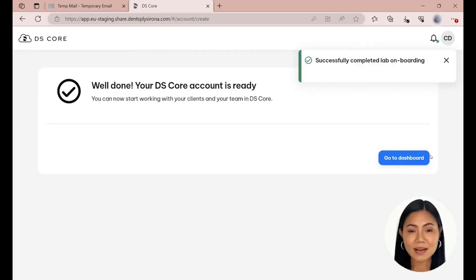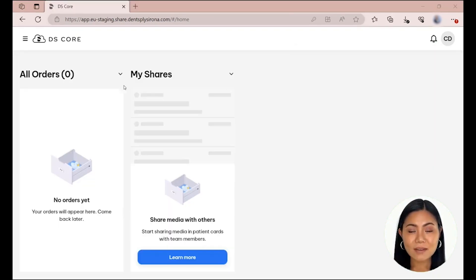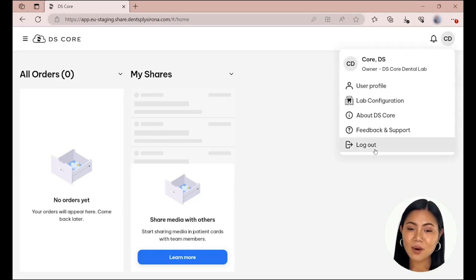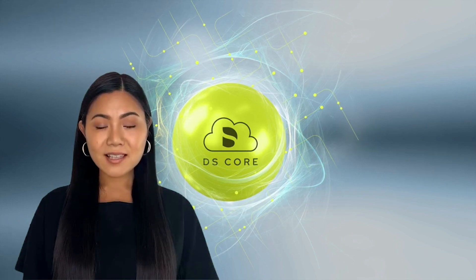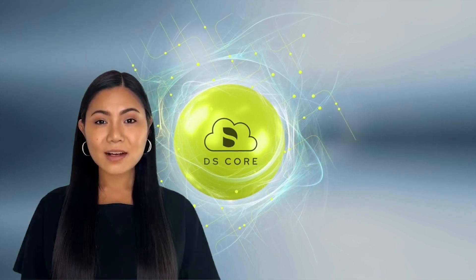Your DSCore account is now ready. To start working with DSCore, click on Go to Dashboard. The dashboard is your starting point to access all your orders, data, messages, and your profile. Congratulations! You have successfully created a DSCore Lab account.